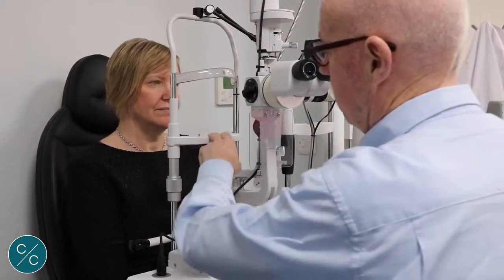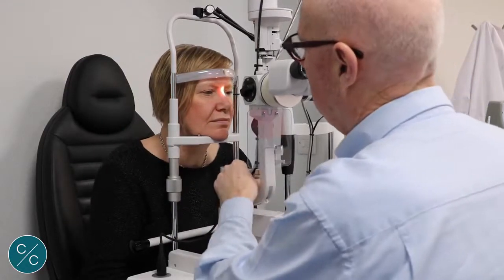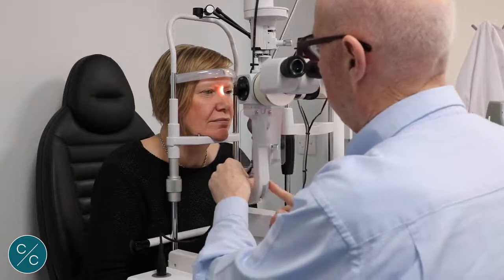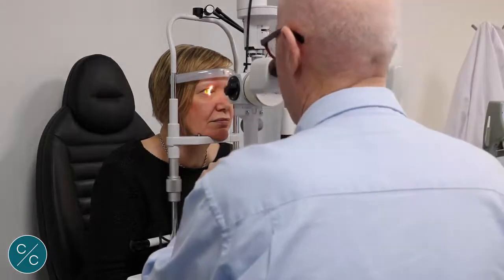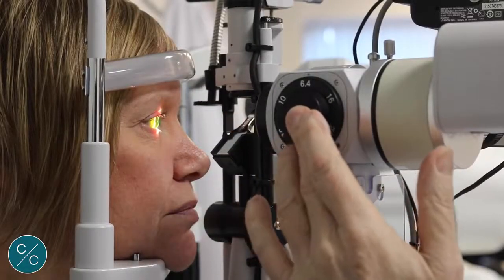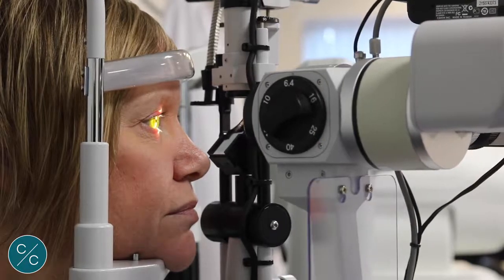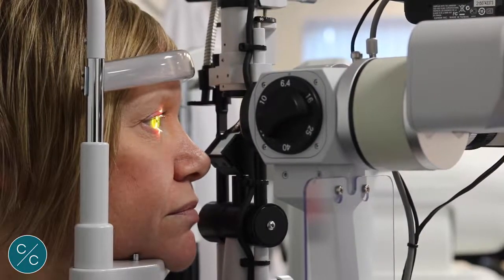So we'll ask Sue to sit forward, drop your chin down onto the rest, forward against the top rest, and looking straight past me. Just checking that the magnification is on the lowest possible setting. Coming in to commence focusing.